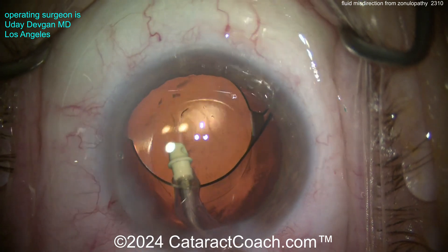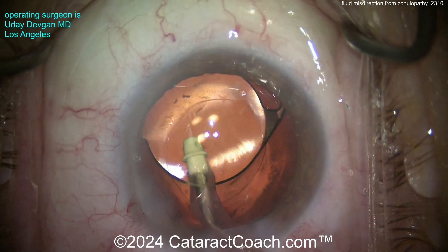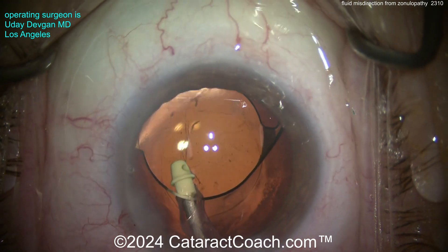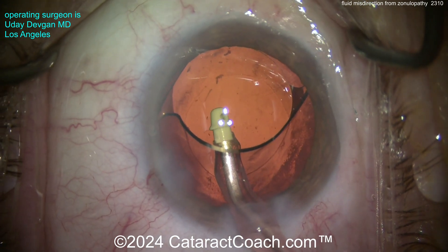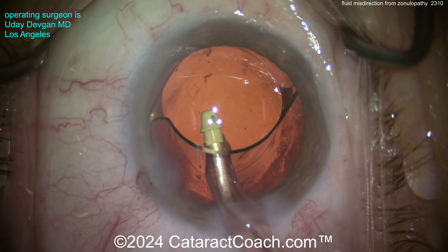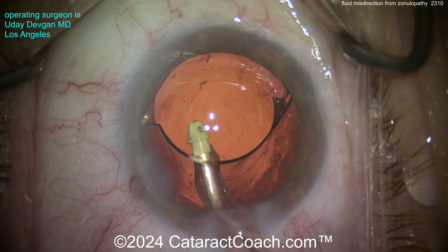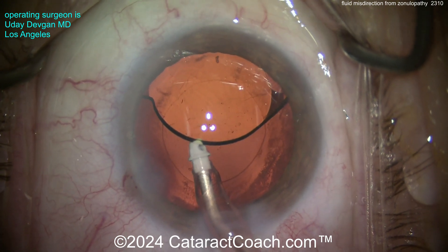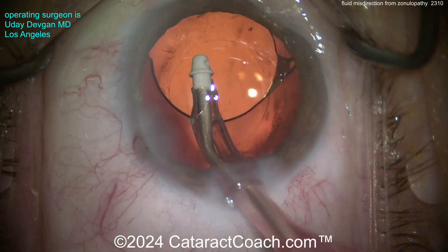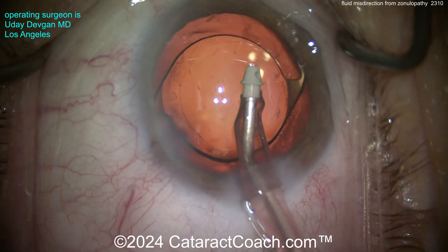Look carefully — if you look behind the posterior capsule there are some tiny little lens fragments there. How did that happen? When you break up the cataract into many small pieces with the phaco probe, tiny little fragments can be pushed with the infusion pressure through the zonular support, ending up right there in front of the anterior face, behind the posterior capsule — that is burger space.